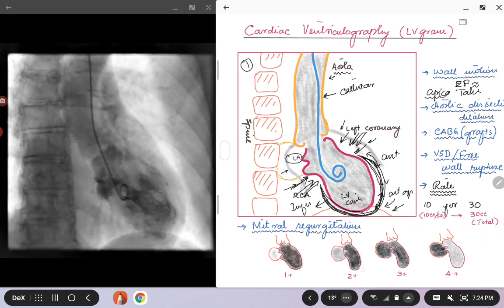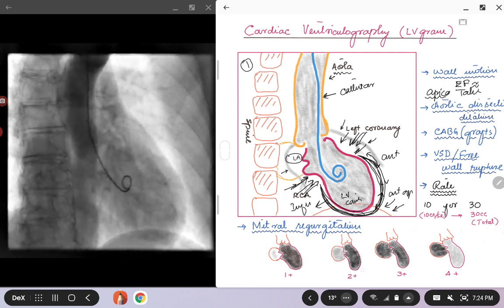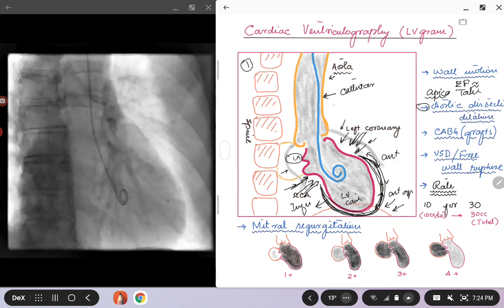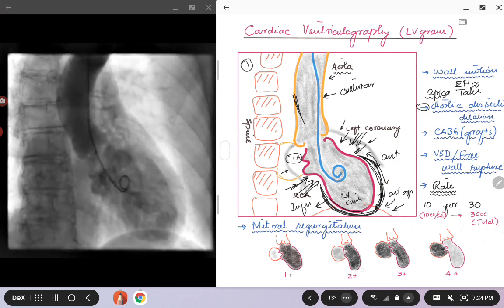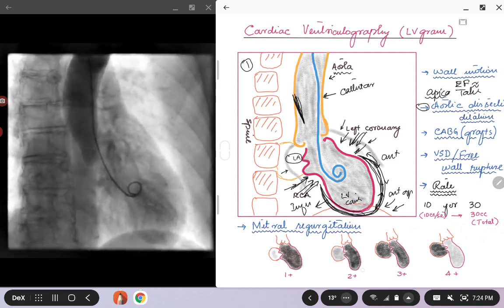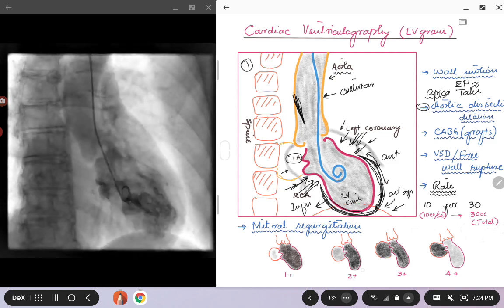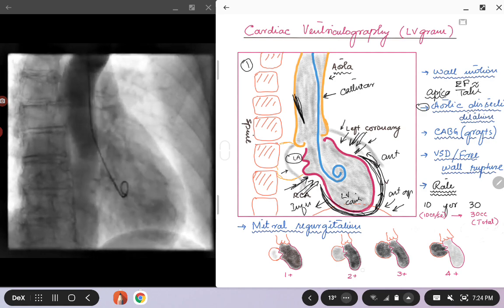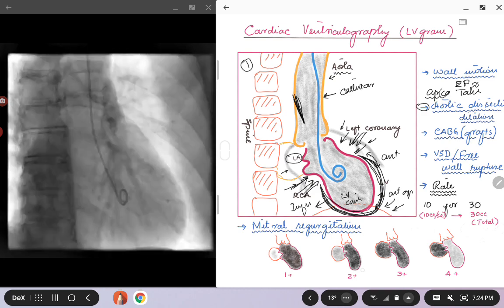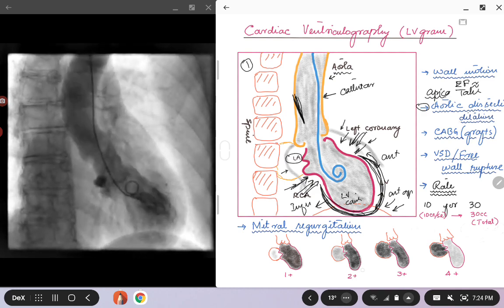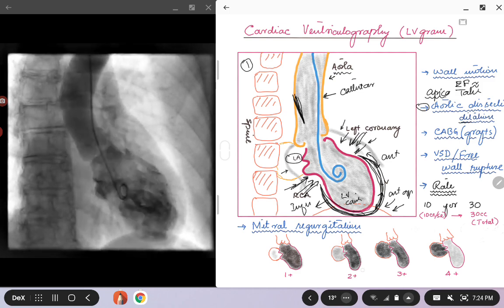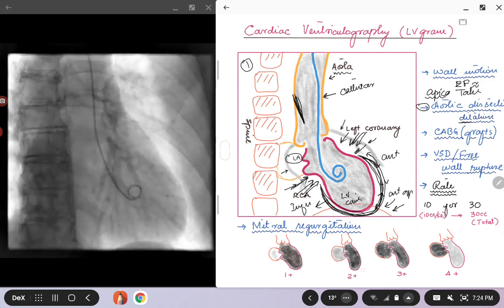You can get a bunch of information by just doing a simple LVgram. Second, if the patient has an aortic dissection you might see a flap in the aorta. You can see on the left in the cine loop the opacification of the aorta and aortic root — it's a little dilated. You can also see aortic root dilatation and aortic dissection in these patients.